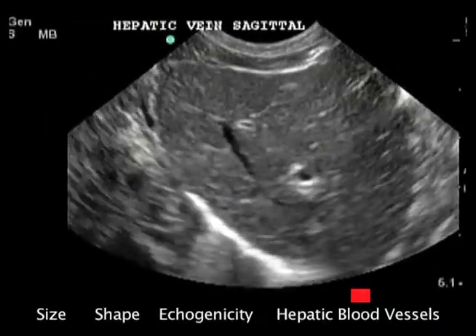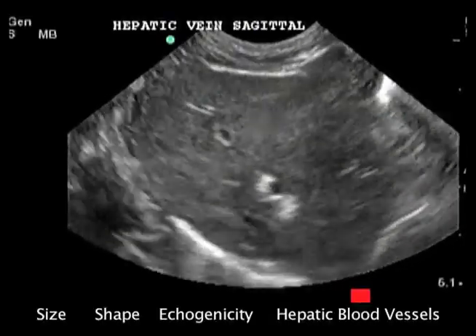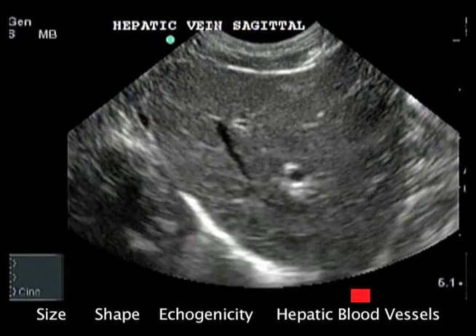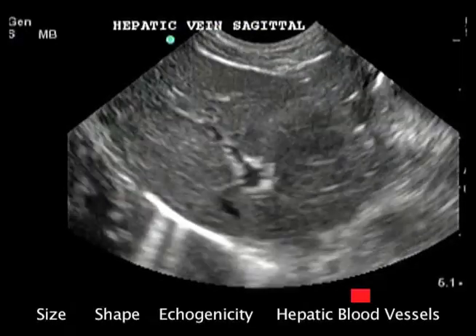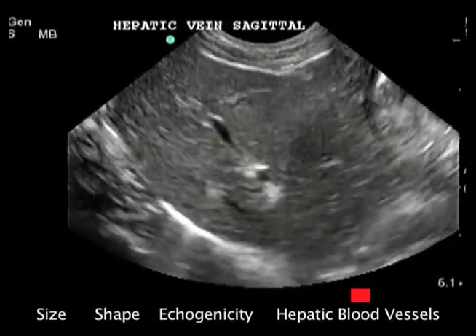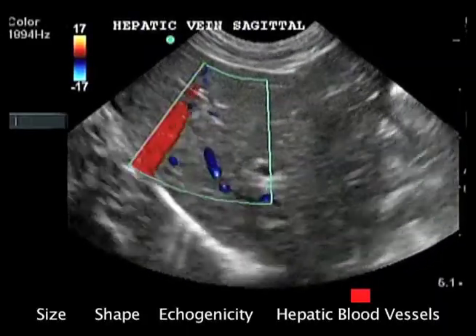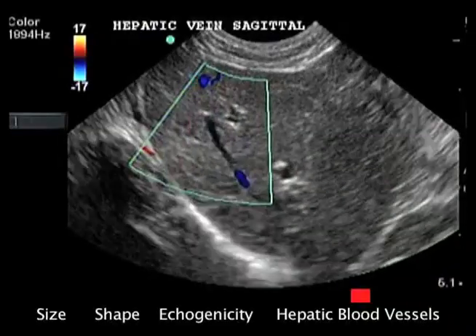In this ventral sagittal view, hepatic veins drain blood from the liver to the caudal vena cava, which is dorsal to the liver. Hepatic veins do not appear to have walls on ultrasound and will appear blue with color flow Doppler because flow is moving downward or away from the transducer. Hepatic veins should not directly connect to the intrahepatic portal veins.